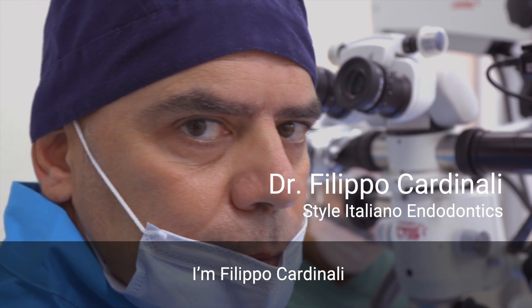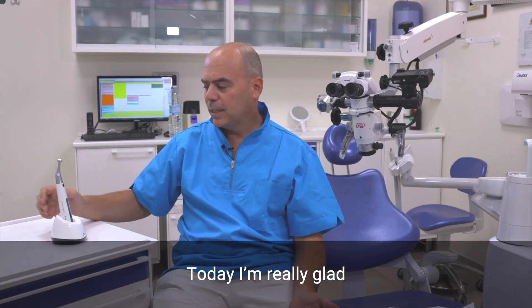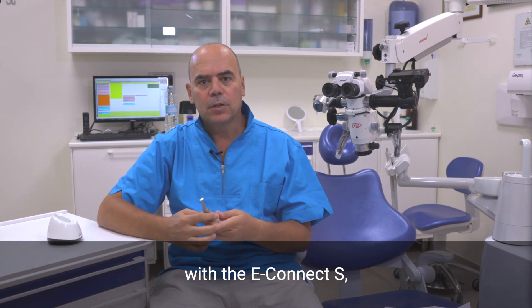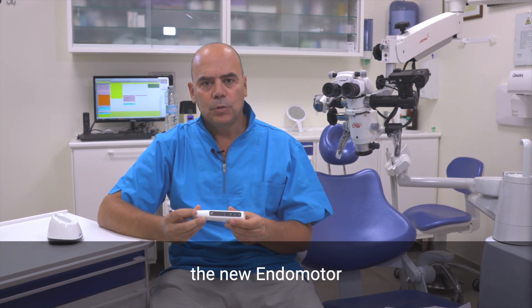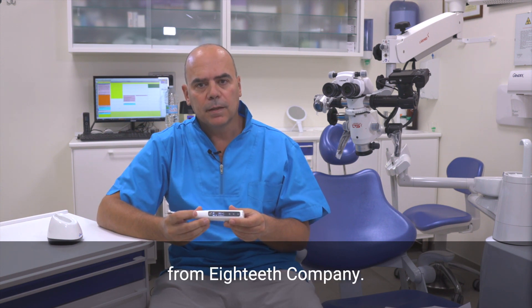Hi everybody, I'm Filippo Cardinali from Style Italiano Endodontics and today I'm really glad to share with you my experience with the E-Connect S, the new Endomotor with the built-in Apex Locator from Eighteeth Company.